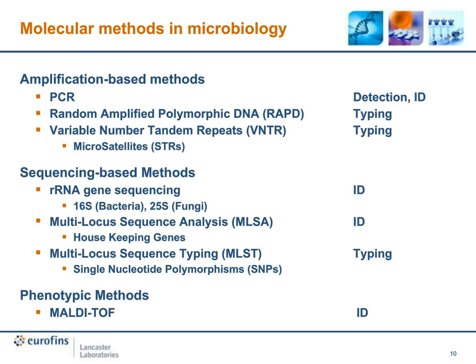We'd like to begin with an introduction to MALDI-TOF, emerging as a valuable phenotypic identification option within the biopharmaceutical industry. We commonly receive requests to provide more information about the science, the system, and the application to IDs.